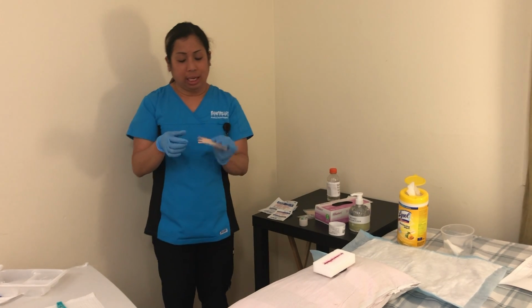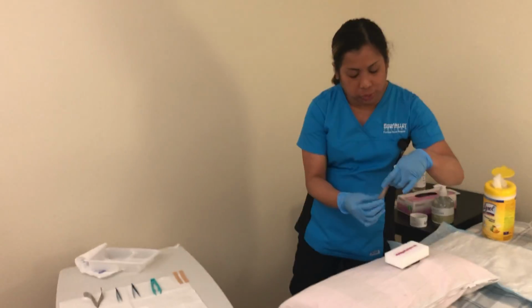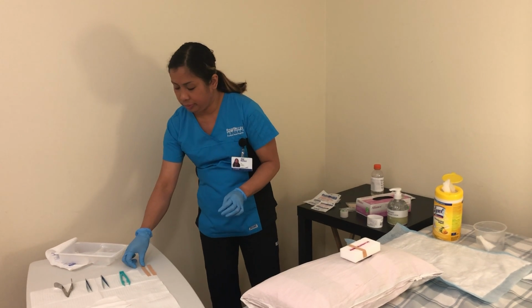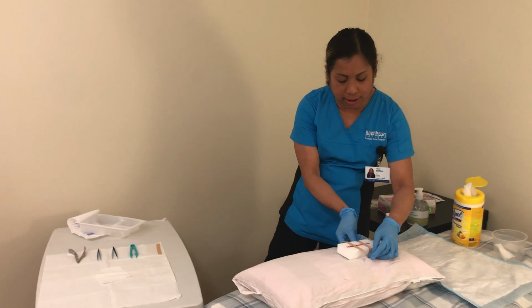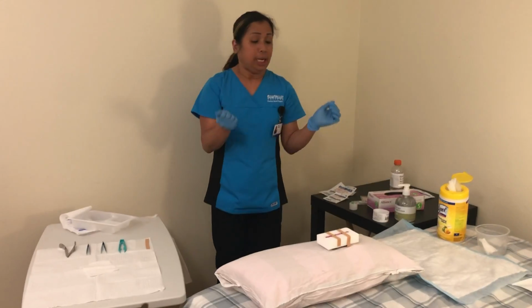Okay, I'll remove this one because I removed two staples. Then I'll put it here. Assuming that it sticks. Sorry, it won't stick. Okay, it is sticking. Alright, thank you.